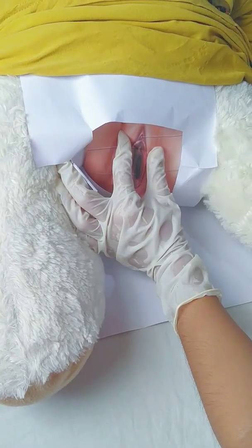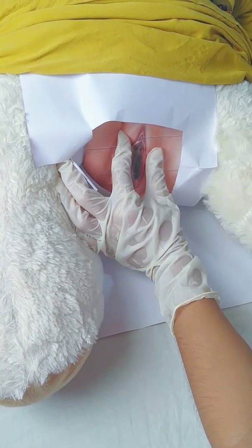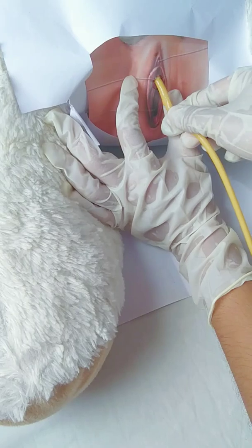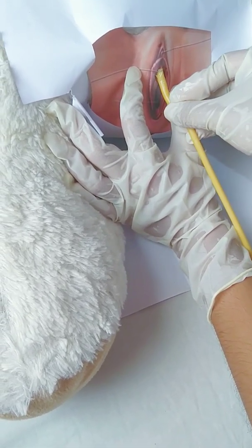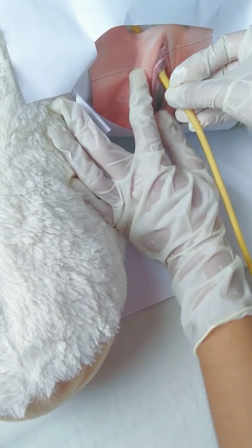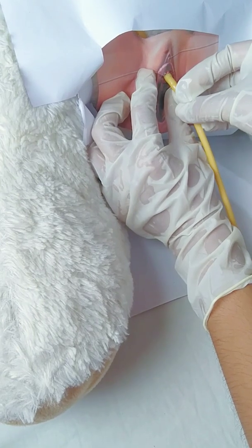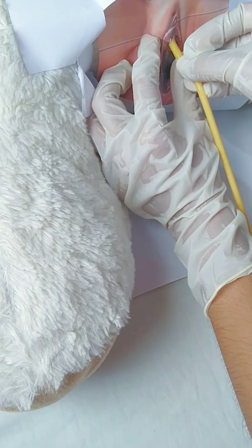Ask the patient to bear down, then with the sterile dominant hand, slowly insert the catheter into the urethra until urine flows. Hold it just like a pen. Insert the catheter until urine flows. Then let's just assume that the urine is already flowing. Then advance the catheter 1 to 2 inches more. Do not force the catheter through the urethra.